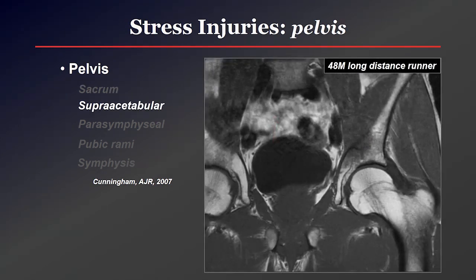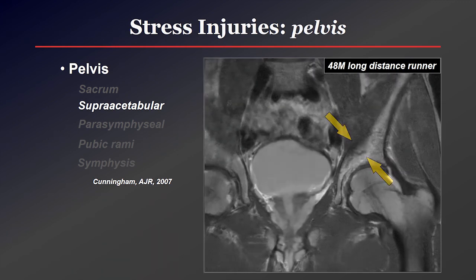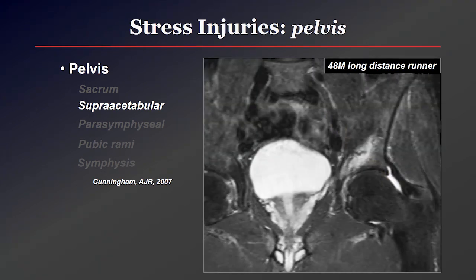In the supraacetabular region, here in a 48-year-old runner, you can see low signal edema on the T1-weighted image. On T2 you'll see a curvilinear fracture line that kind of parallels the superior acetabular margin — classic for these supraacetabular stress fractures, sometimes called an arched eyebrow configuration.